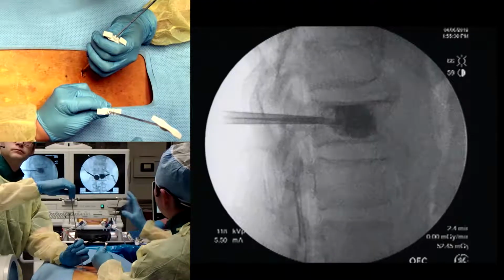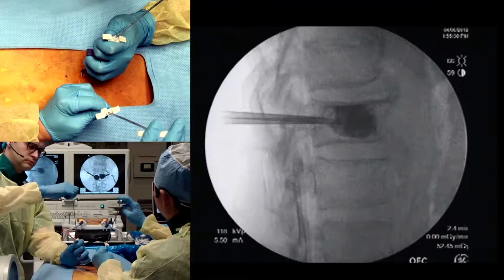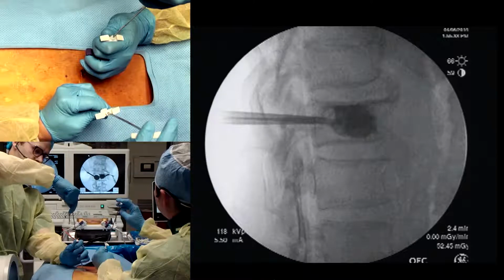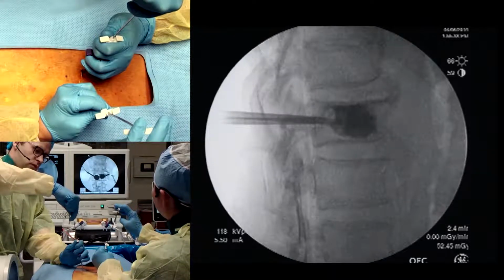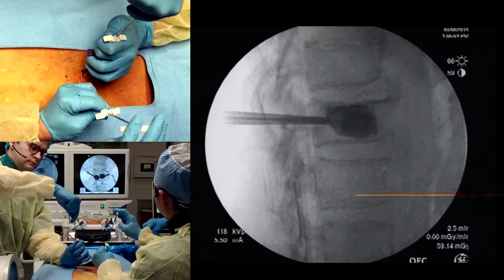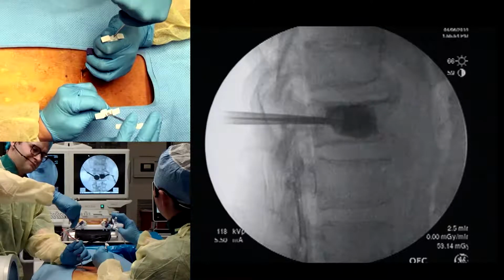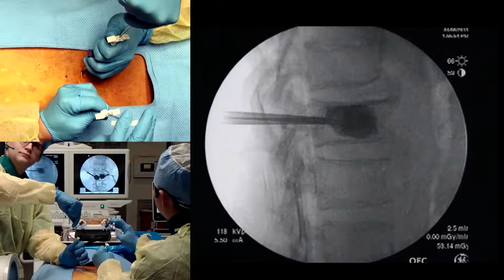So let's try to get to that middle to posterior zone. Try to get a little bit of fill in that back part of it. I can tell it's starting to get harder, right? Yeah, it is. It's starting to cure. Picture that. Look at that fill. That looks great. So once we do this, it should be 4.5 cc's. Picture that.